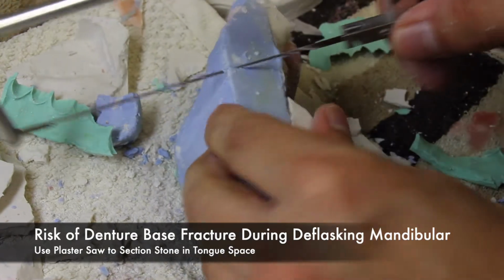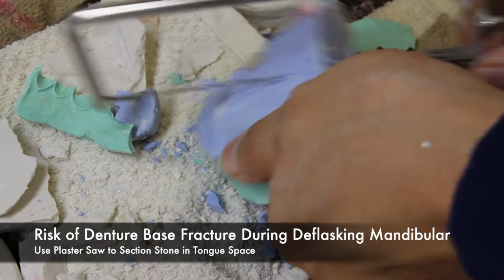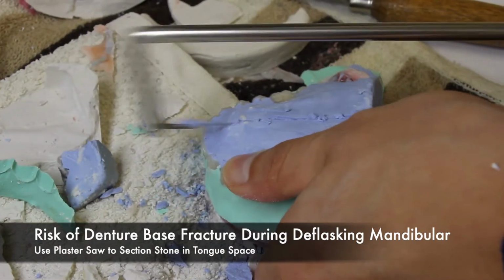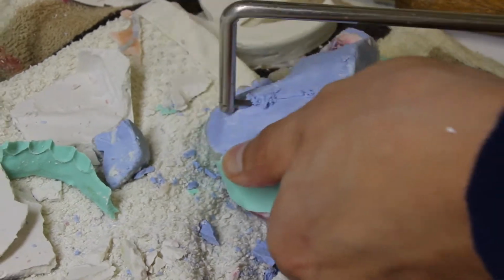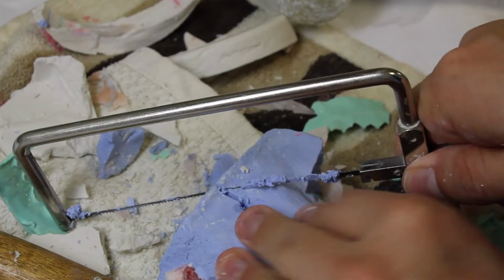The mandibular denture tends to be the one that's most difficult to deflask. This is due to the tongue space. There's a large risk of the denture base fracturing when trying to remove the stone from the tongue space. Making use of that plaster saw is a great way to avoid the risk.